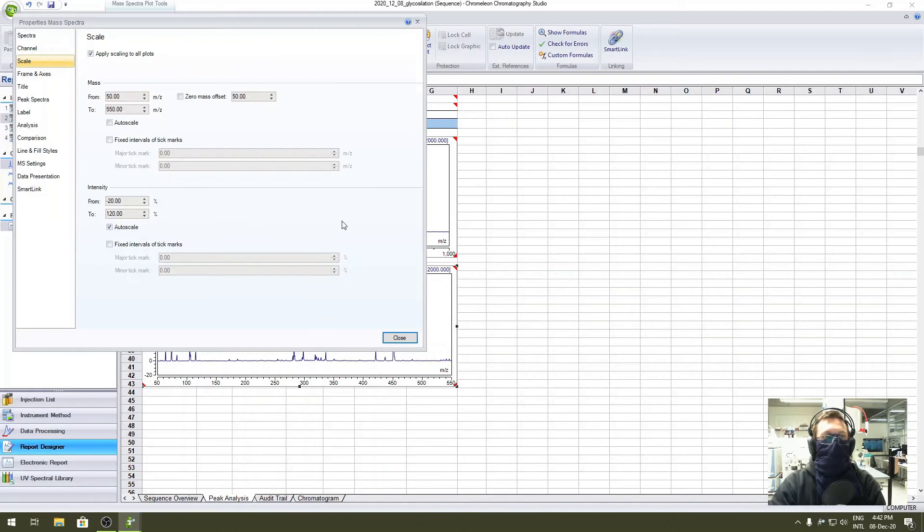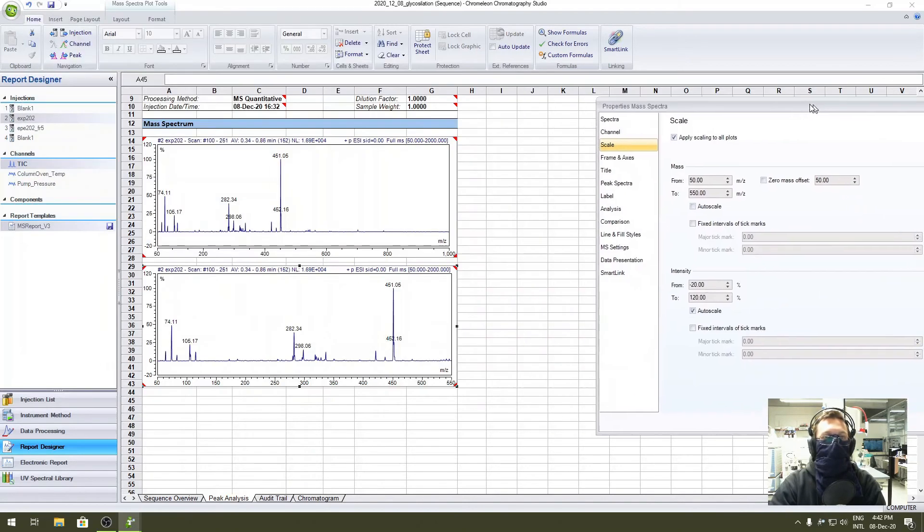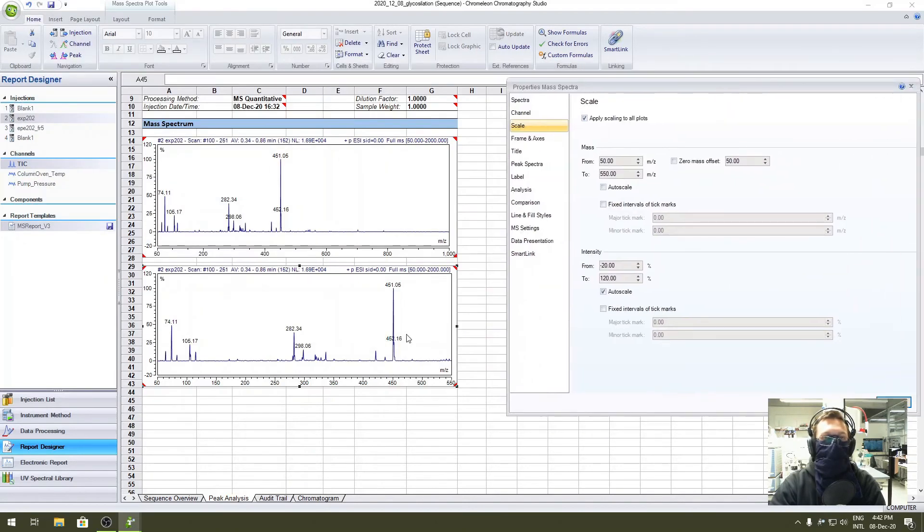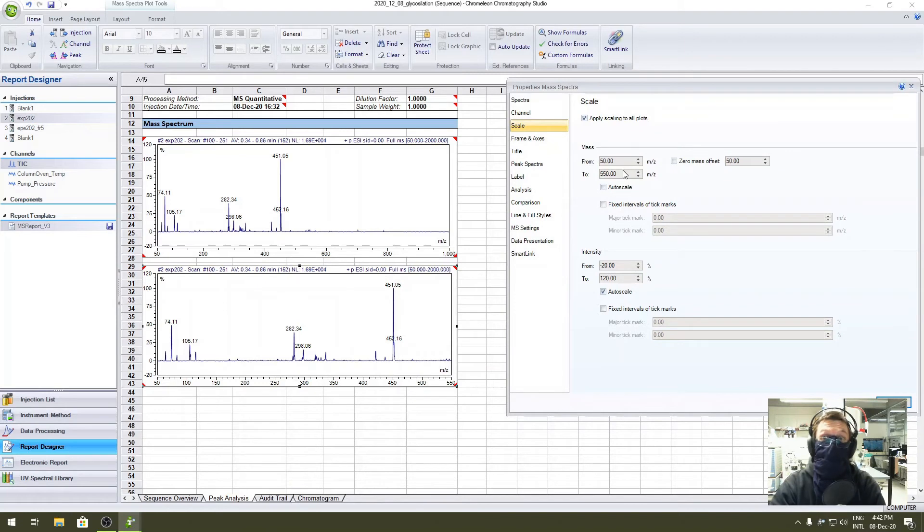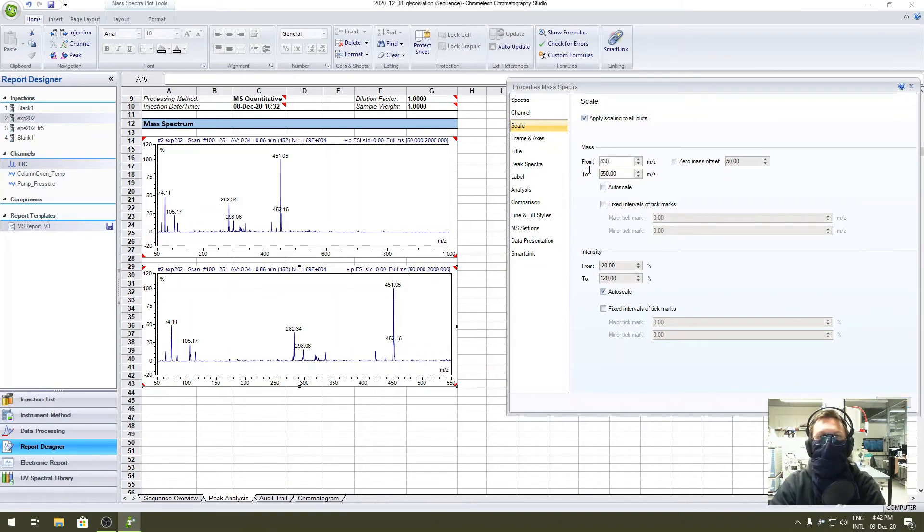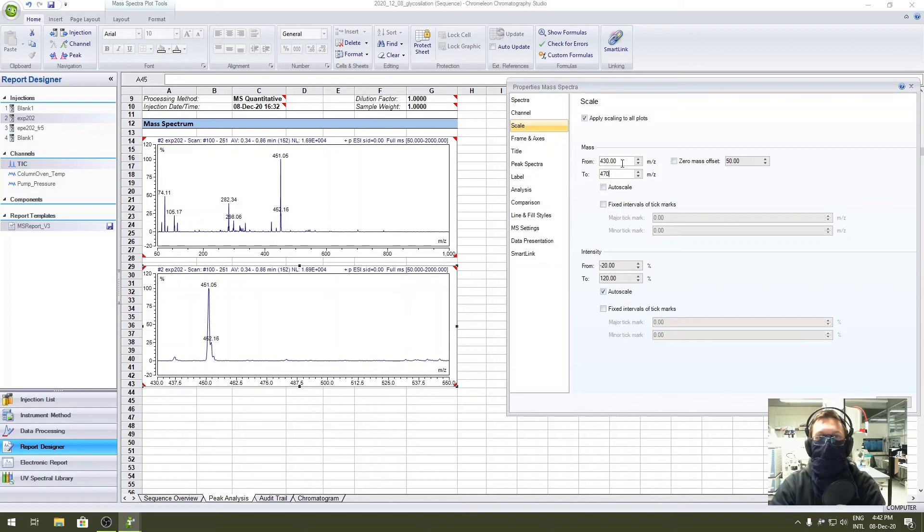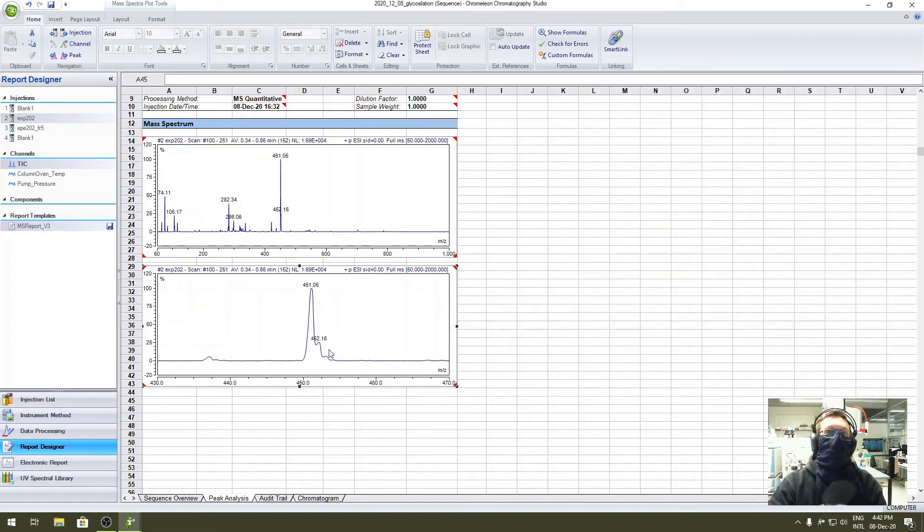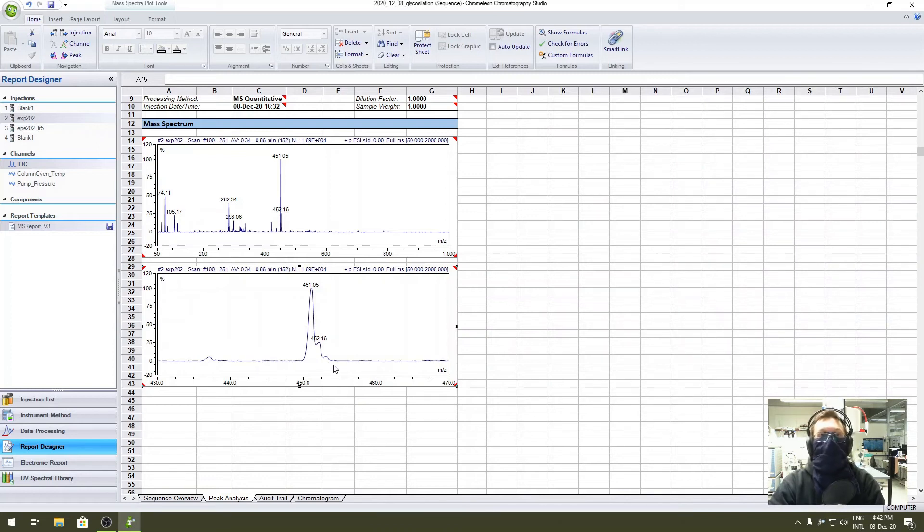The second spectrum is intended for the detail inside of the peak shape. Double-click to it, and let's say we want to see in depth the peak at 451. So we go from 430 to 470. Now we clearly see the isotopic pattern of this peak.